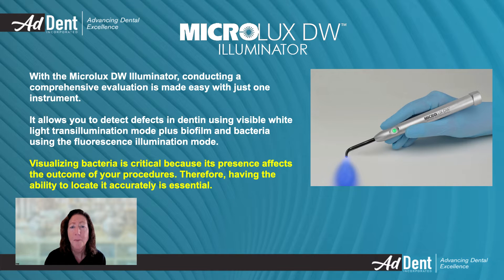Hi, my name is Marian Hessemeyer from ADENT Incorporated, and I am presenting why the MicroLux DW Illuminator will enhance your evaluation procedures. The MicroLux DW Illuminator has dual wavelength modes that enable a thorough evaluation. With its white light transillumination mode and near UV fluorescence mode, it is possible to visualize defects and bacteria that can affect your patient's oral health.